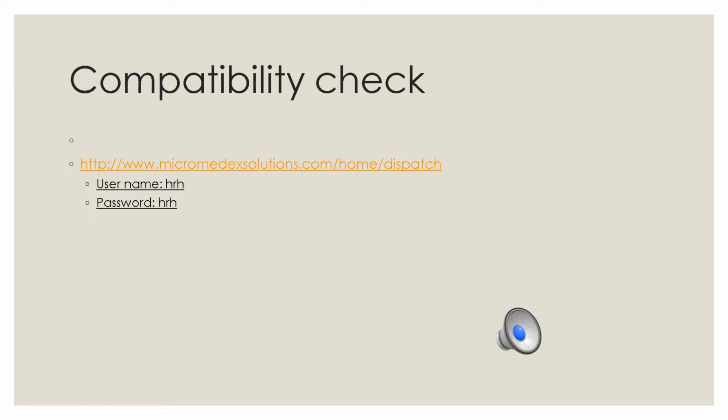If they are not compatible, you're going to have to stop the IV fluids, flush with saline, give the medication as calculated at the correct time, and then flush again with saline. This compatibility check needs to be done before clinical. If it's not, you could get a critical incident and be sent back from clinical, which would be a sad day.